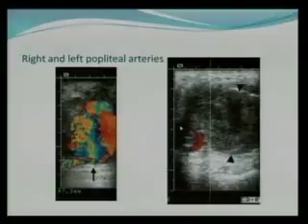All right, so here I'll just let you know this is the right and this is the left popliteal artery. In the right popliteal artery, we're seeing that, of course, it's abnormally dilated, and then there's swirling of blood, or the yin-yang sign, occurring within the popliteal artery. There's red, blue. What does that mean? That the blood is going at 360 degrees within a cavity, and that's when the blood swirls. And on the left popliteal artery, again, it's very enlarged. It is aneurysmal, and you're seeing a thrombus.